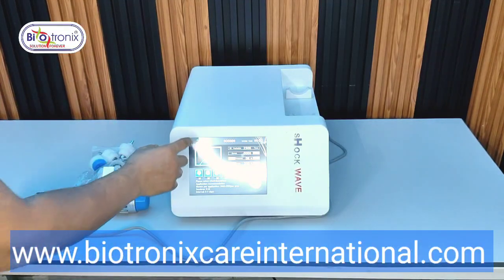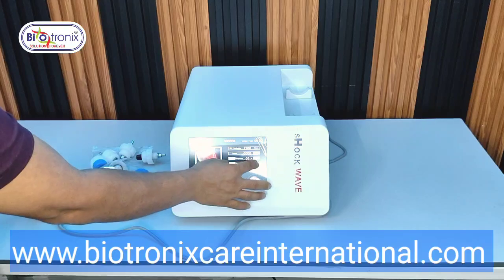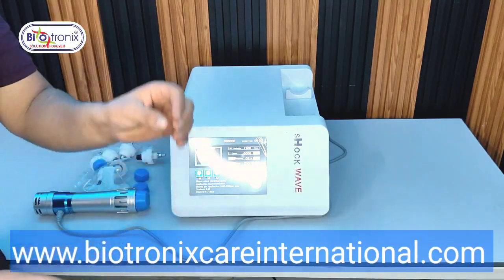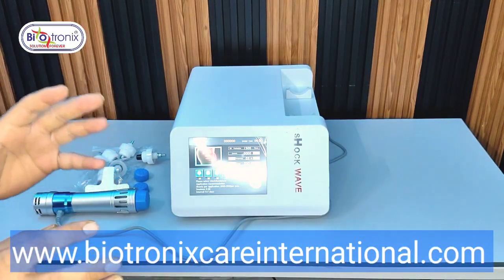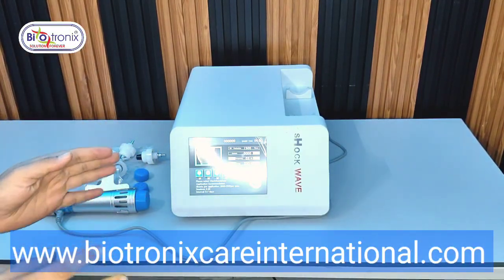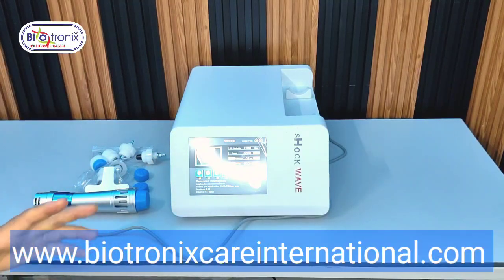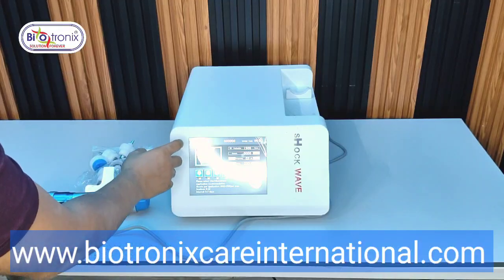So according to the joint, now you can see that if you select ED, the maximum intensity you can go up to is 30 millijoule, because 30 millijoule is quite effective and strong enough for erectile dysfunction. I will show you the intensity you are getting by using the same in the following minutes.